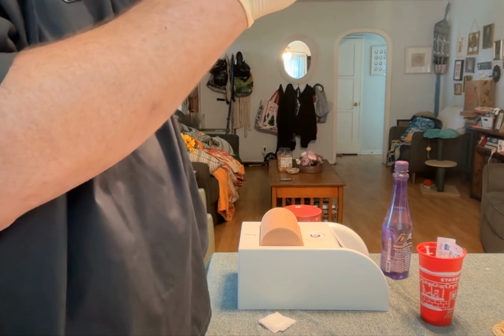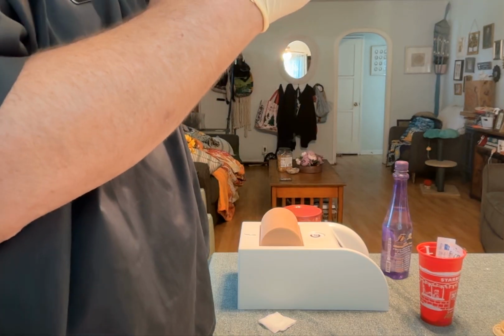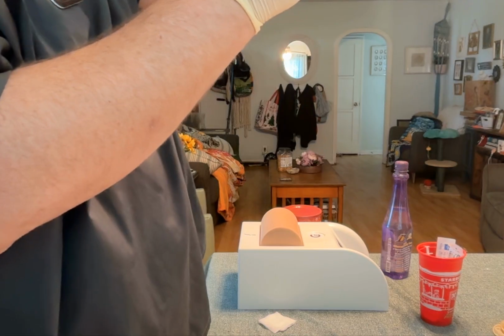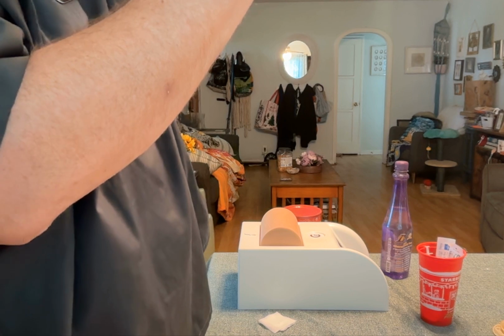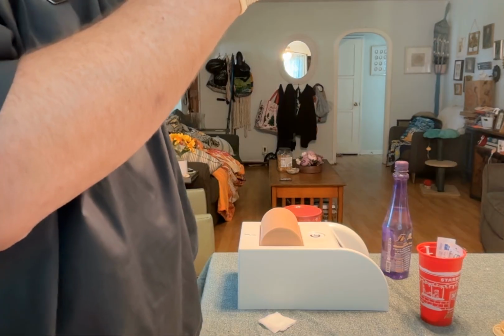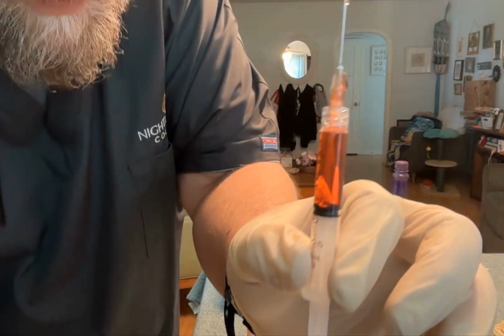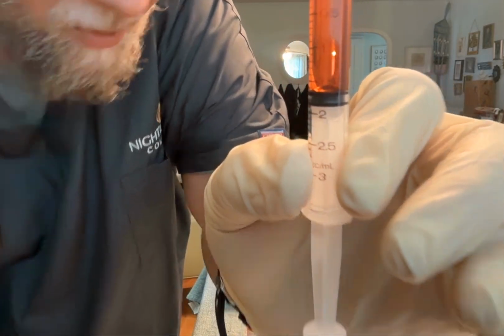So I'm going to re-inject that, get rid of my bubble and come back down to 1.5 milliliters of medication. Okay, I have 1.5 milliliters of medication, in this case morphine.